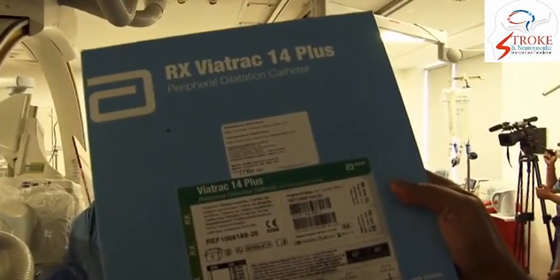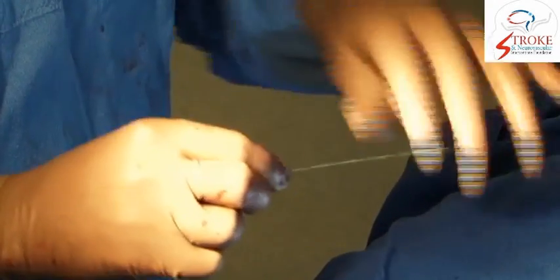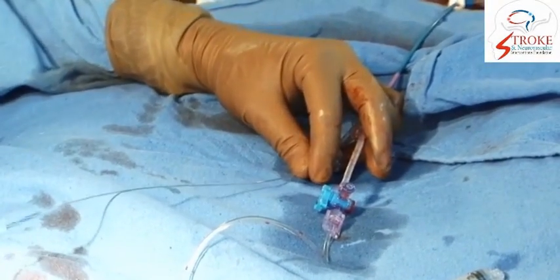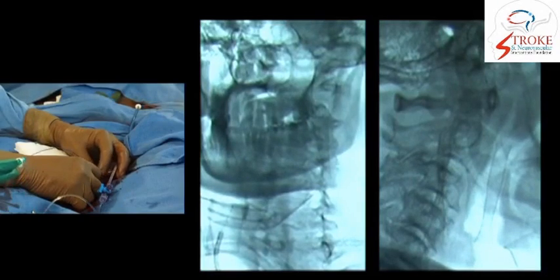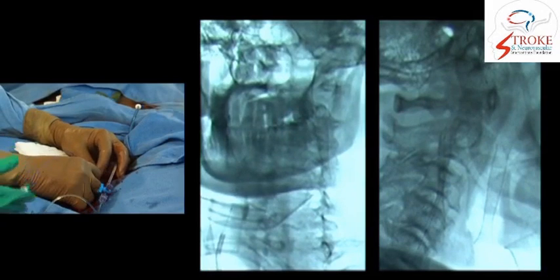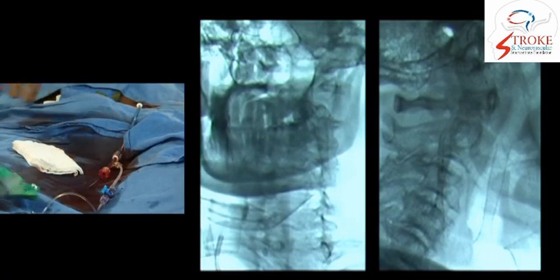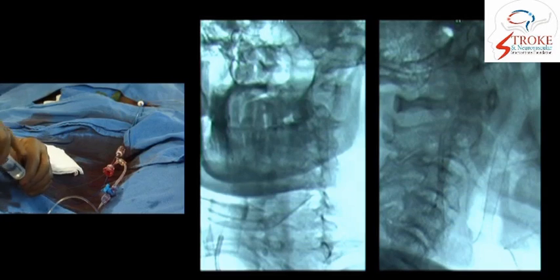So the post-dilatation was performed using a 4 mm diameter balloon, 20 mm long. Balloon being introduced into the guiding catheter. Here you can see the balloon in the stent. Now it is in the right position. It is fixed. Again, as we have shown previously, balloon being prepared, being made air free.